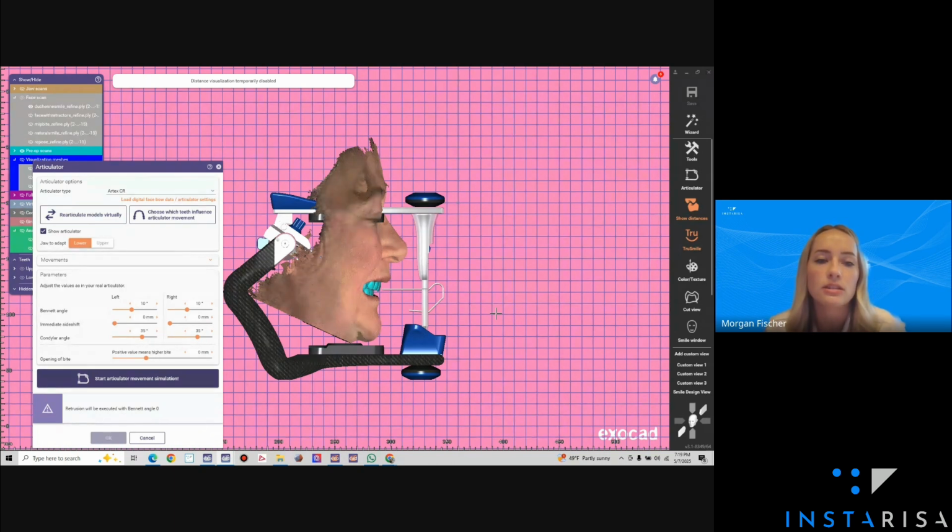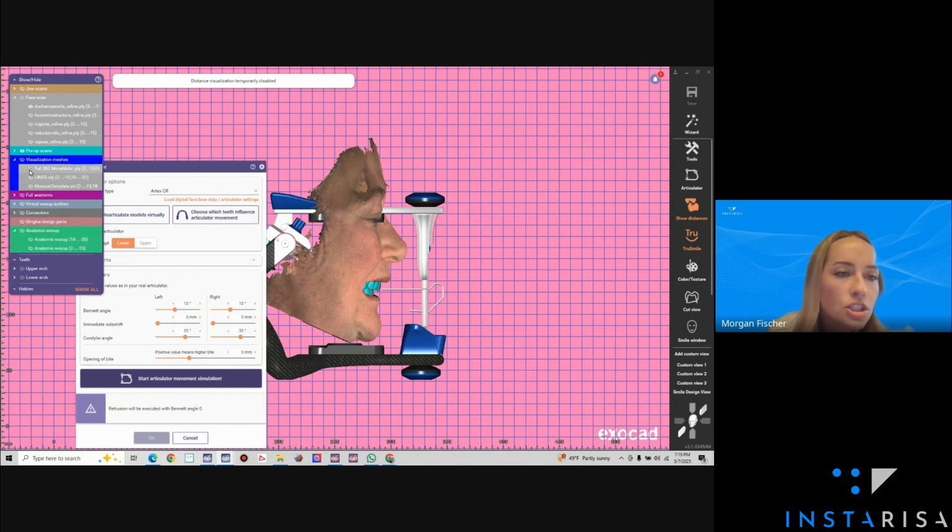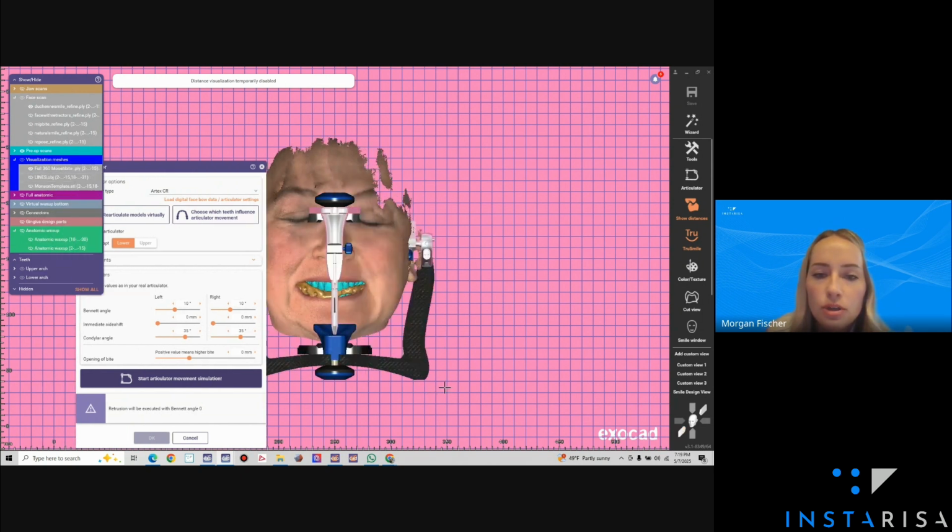And then also just preoperatively, when I'm looking at these scans, I'm checking the patient's side profile and making sure that I feel like their side profile is adequate enough and we don't need to open the vertical anymore. So this patient looks good. I believe she was opened preoperatively.